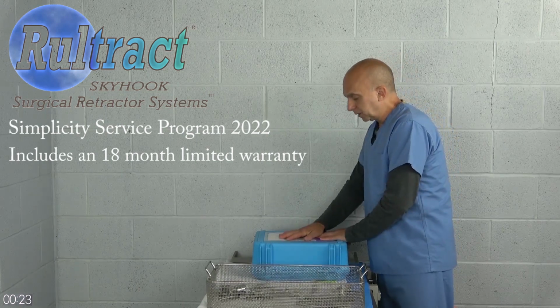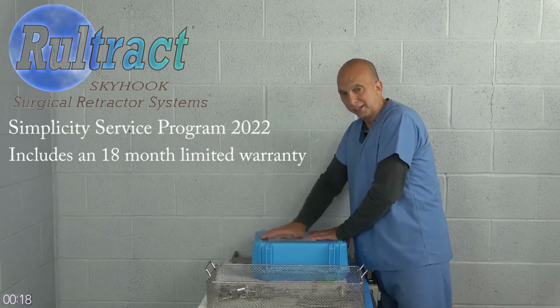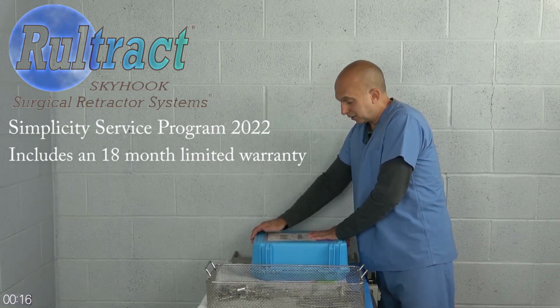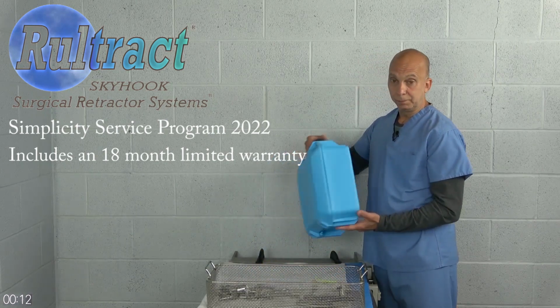And then be sure that the label is actually secured to the case. So go ahead and push on that. Make sure that it's attached and stuck to the case. Now the equipment is ready to ship back to Rultract.